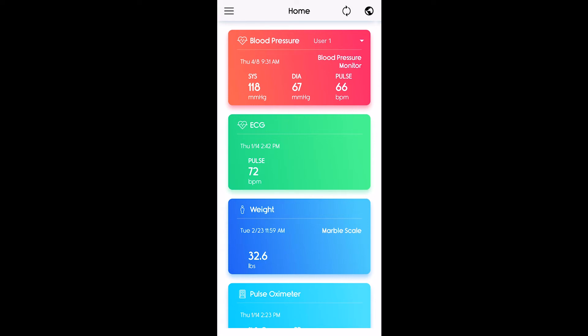Now that you've signed up for the Vibe Precision app, I'm going to show you how to enable the remote patient monitoring feature.